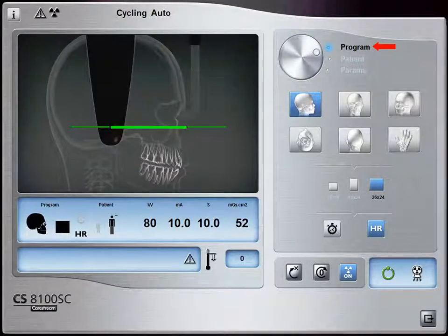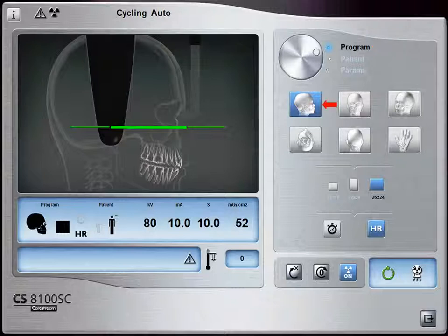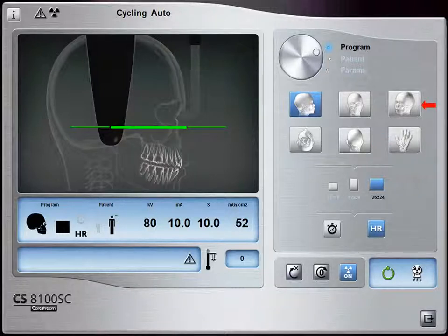The Program pane is used to choose the different radiological exams and acquisition formats. Click Lateral Image to acquire a lateral exam, click AP Image to acquire an anterior to posterior exam, click PA Image to acquire a posterior to anterior exam, click Oblique Image to acquire an oblique exam, click Submento Vertex Image to acquire a Submento Vertex exam, and click Carpus Image to acquire a Carpus exam.